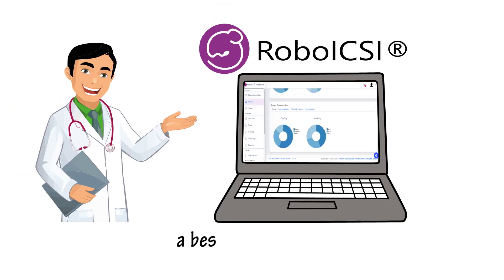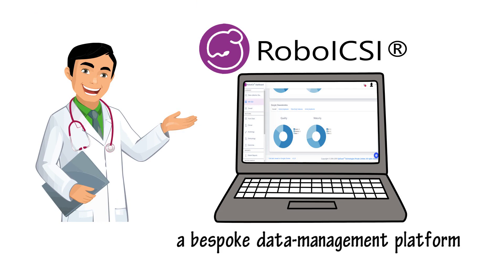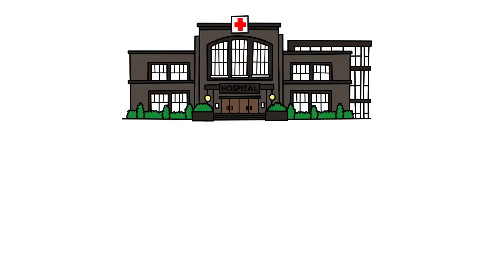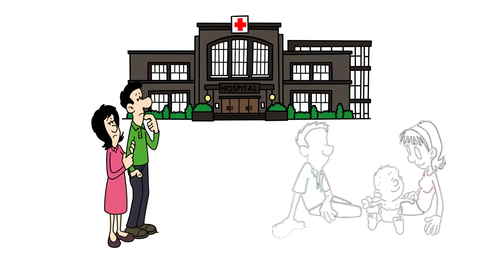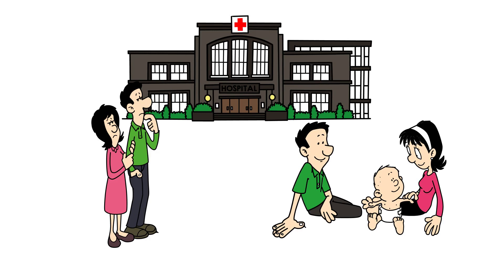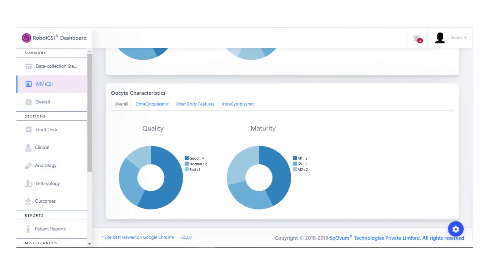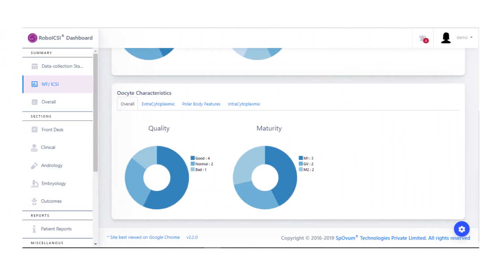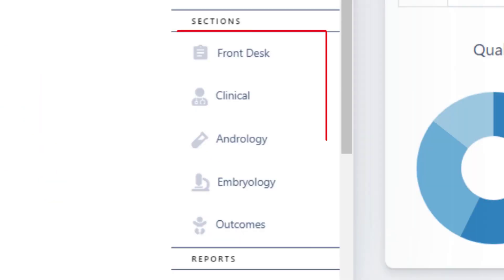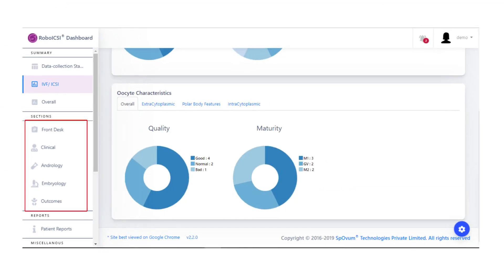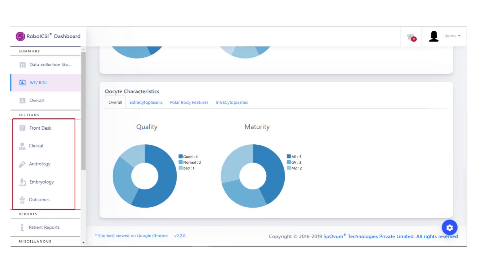Robo-ICSI Dashboard is a bespoke data management platform that enables capturing data from patient walk-in to the delivery of the baby. It offers a holistic end-to-end framework for capturing, storing, summarizing, and analyzing data from various sections, and authorized users are allowed to manage role-specific data.